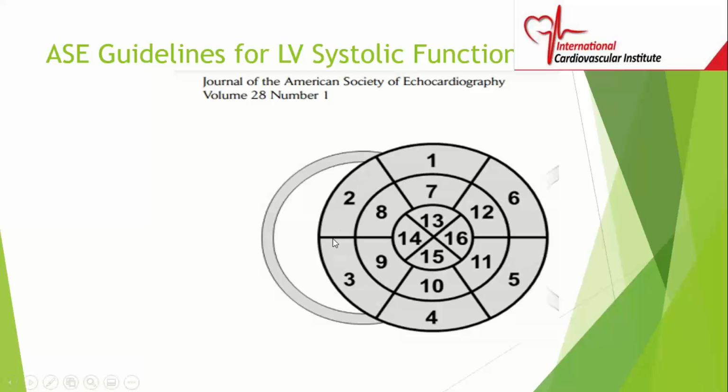Now, this area is the septum. So segment 2 and segment 3 is the septum. Segment 2, which is close to the anterior wall, is the anterior septum. And segment 3, which is closer to the inferior wall, is the inferior septum. And then this is the lateral wall over here. 6 and 5 is the lateral wall. 6 is close to the anterior wall, so it's the anterior lateral wall.